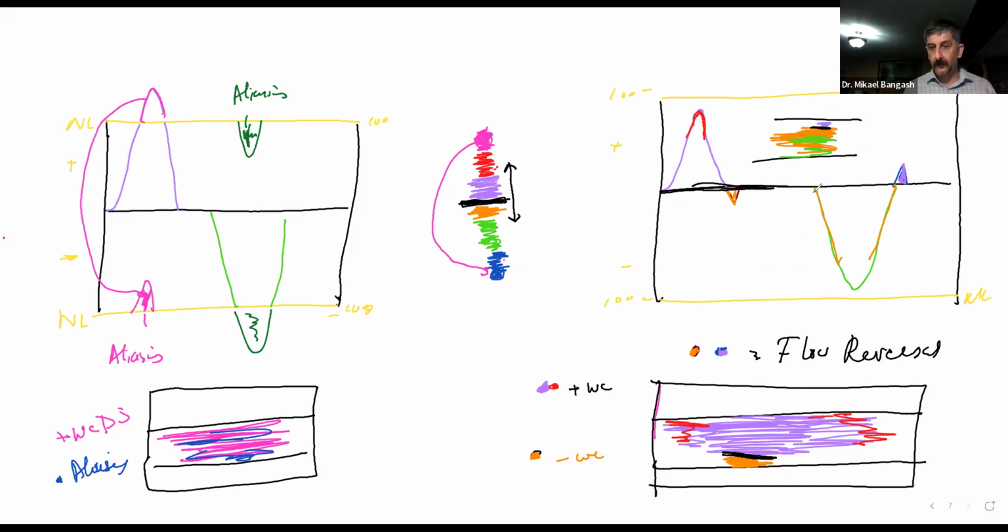If you cut up all the graph, low Doppler shifts, higher Doppler shifts, it goes from the higher to lower, through the baseline, and then negative, and then positive.